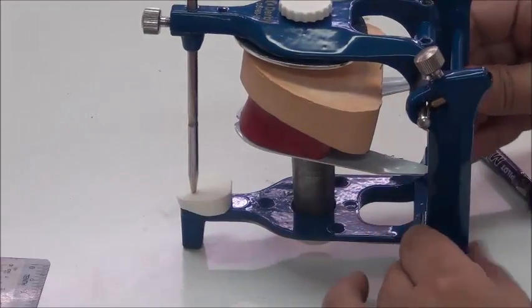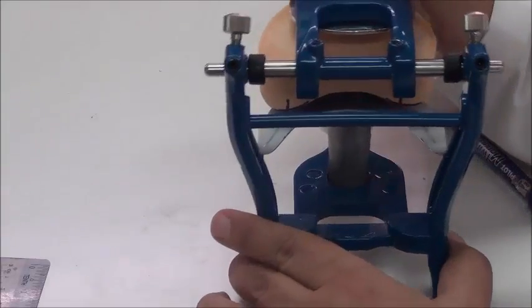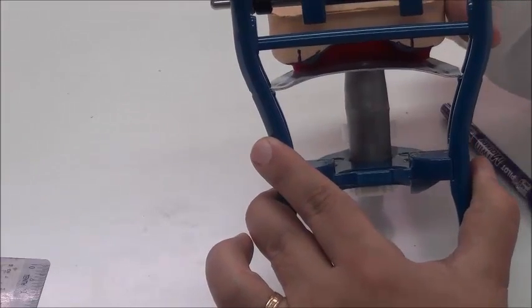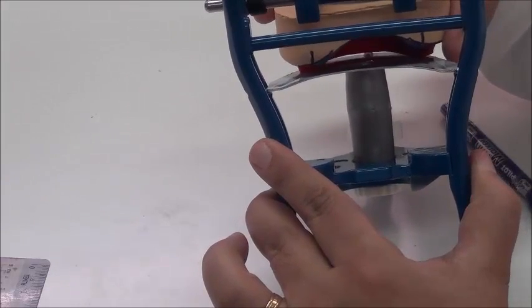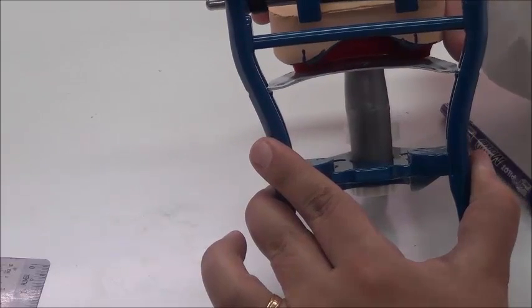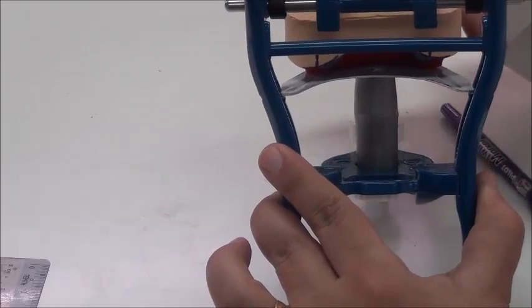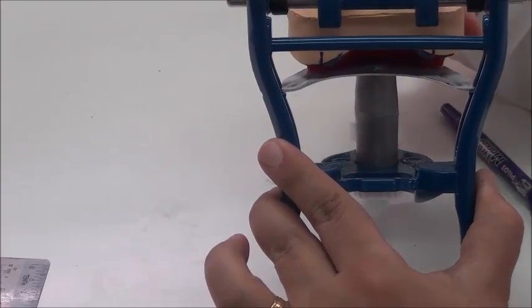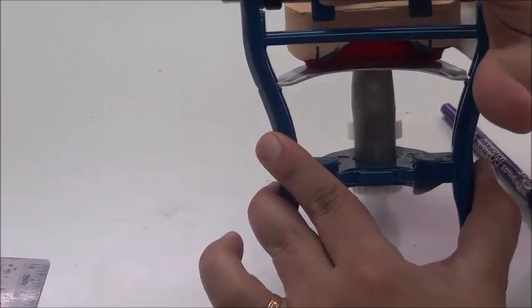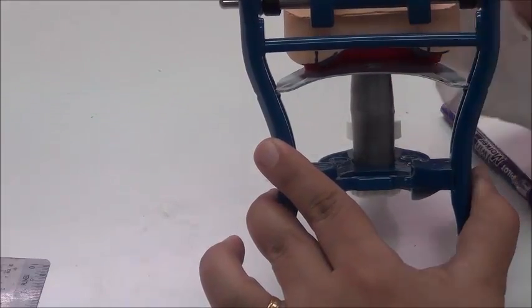So I'm going to look at this cast from posterior. I'm going to compare the heel area. The heel area is the area that we have drawn the arcs on. So this is called the heel area of the cast. And I want to make sure that the cast is not shifted to this side or this side. That it is totally centered. So I'm using these two lines that I've drawn from the arc to make sure that they are centered. So here I'm using these two vertical components of the articulator that are running down and trying to compare them with the lines.